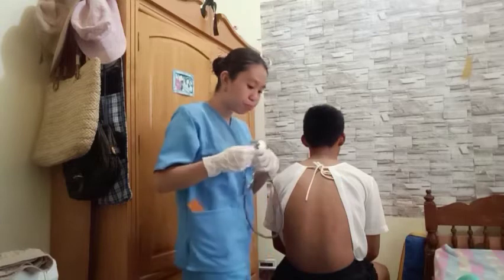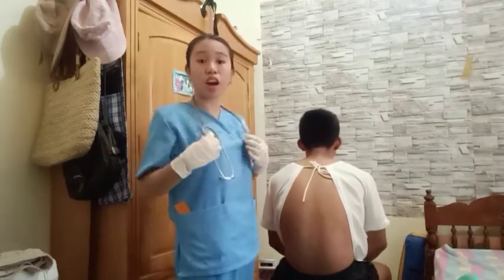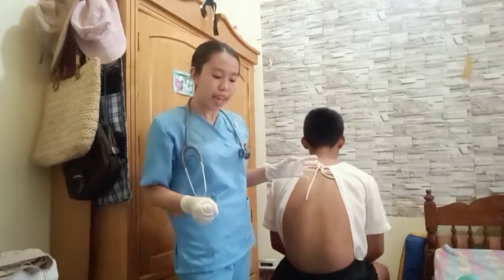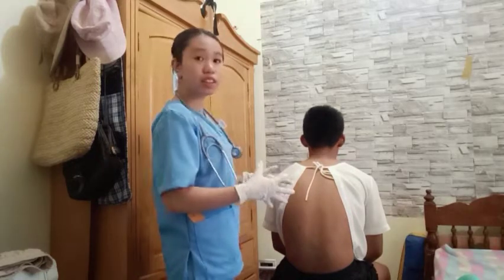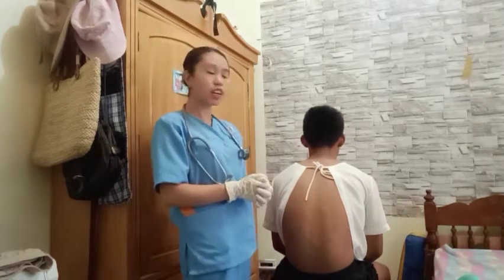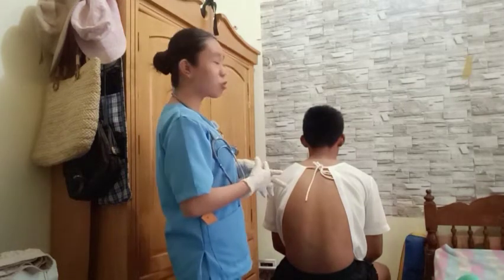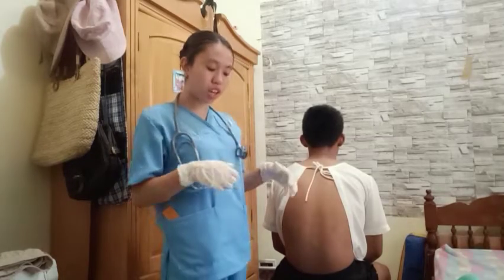Okay. Thank you. So as I am auscultating for the breath sounds of the patient, I haven't observed any adventitious sound or any abnormal sound made in this assessment. I also haven't observed any crackles or any friction rub, which all in all gives us a good sign.